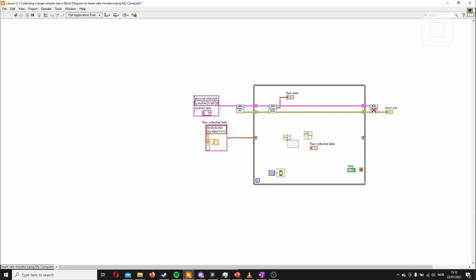So what we want to start with is to take the data points of the waveform out of them, like unbundle them. The options we have here to select is T0, the start time, dt, the delta time, so the sampling rate, and Y, the waveform, the actual data points, and the attributes, which is something more complicated, which we will ignore. We'll take the waveform from here and from here, because we want them to be placed together. These are just simple arrays now. We'll just move this one away.